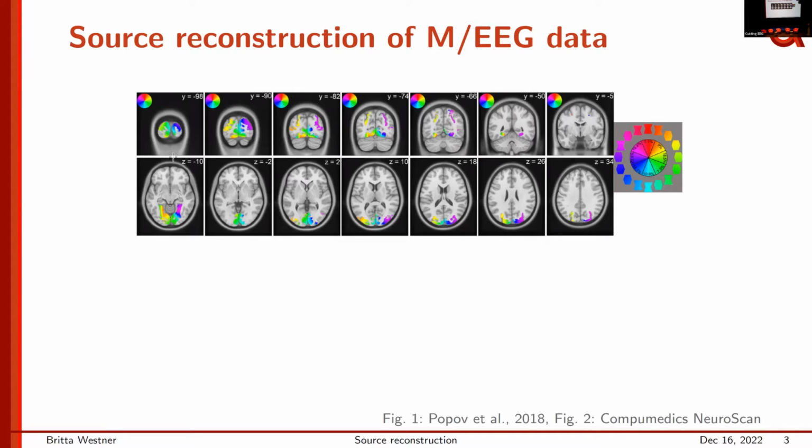So I guess many of you are familiar with pictures like that. And you might think, yeah, I've seen that in one or two fMRI papers. It's nothing special, right? But this figure was actually obtained with EEG. So a method that does not actually image the brain, but records activity outside of the scalp.